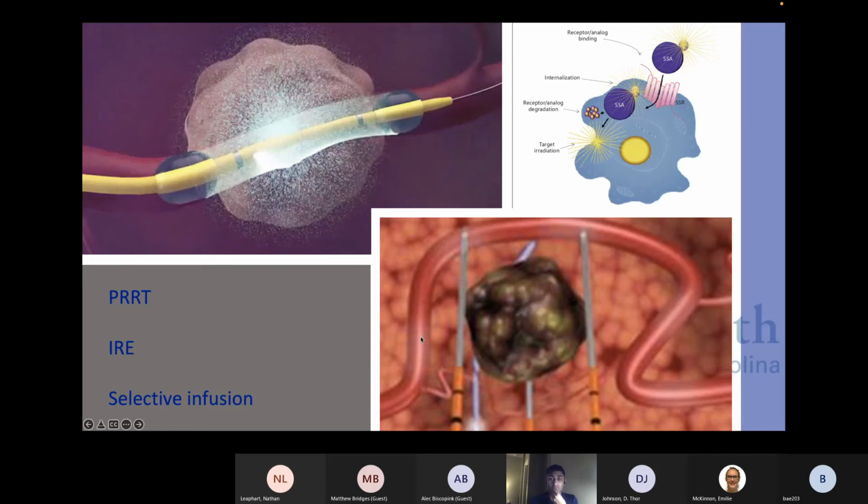And then the other thing I'm showing you here is what's called NanoKnife or irreversible electroporation. So many of you who did transfection experiments when you were undergraduates, or during your PhD, were transfecting cells by doing rapid polarization, depolarization, which opens up channels in the cells based on the sodium potassium channels. And so you can get RNA and plasmids into the cells in order to actually treat them. So with irreversible electroporation, you kill the cells.